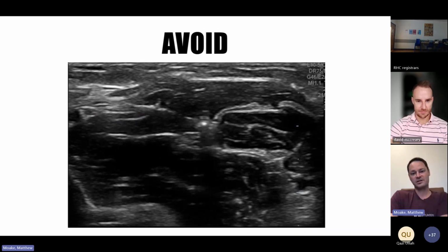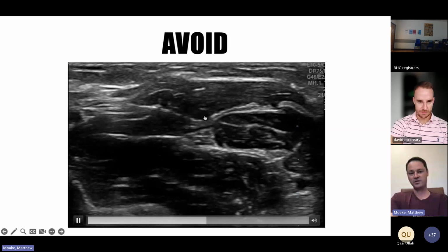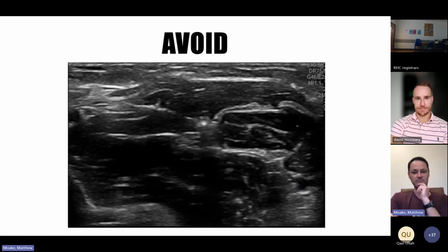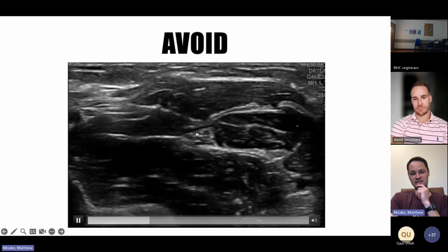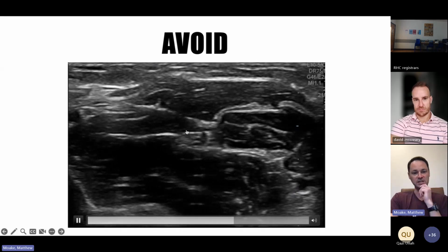So here the provider is starting at the top of the nerve. And so you can see the nerve is here. They've come in at top. And in their injection, they're putting in this hyperechoic lucency. So this is air that they're injecting. That's just a little residual within the needle. The downsides of coming in above the nerve are A, that you could put in air. B, your anesthetic is going to push your nerve down a little bit, versus if you're below it, it'll lift it up to you some. And so it makes it easier to do kind of ongoing manipulation if you need.